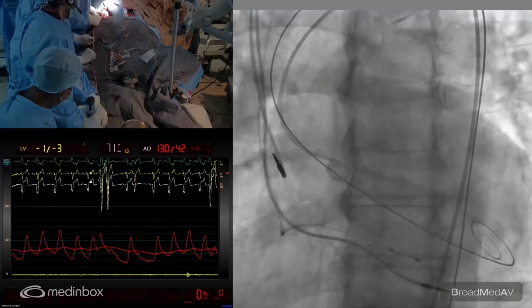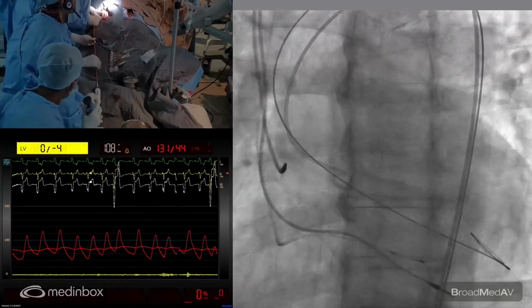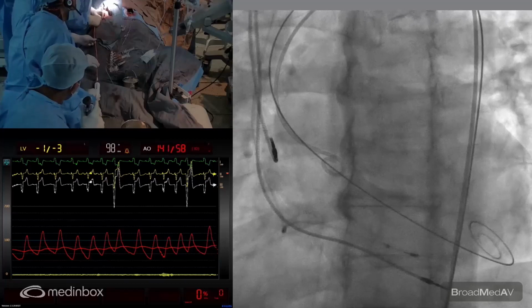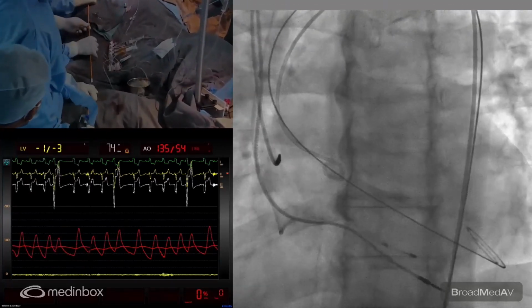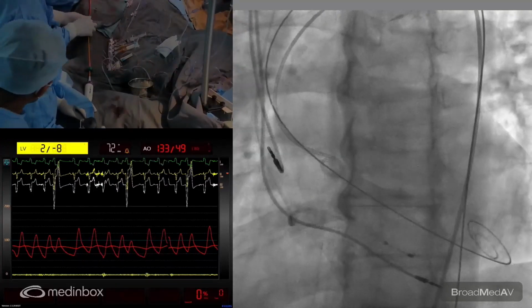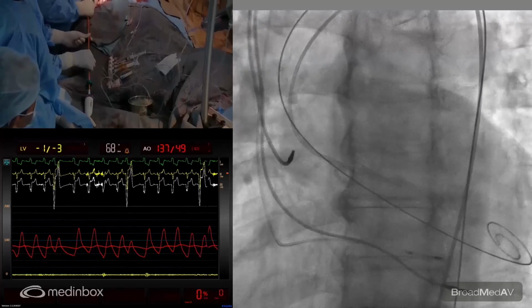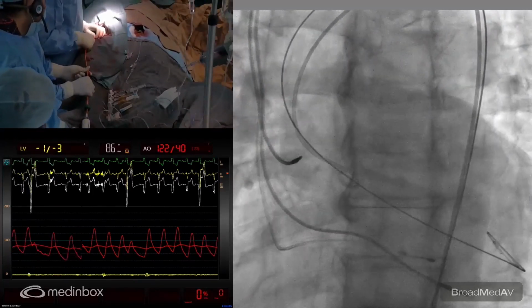So you need to slowly, gently push this off. There's a bit of arm required. Hold the wire back gently, Ashish. Yes. We can remove the loader now. Yep. I'll do that. Very important that you pull the loader out slowly so you don't get a splash. And you're all the time watching the pressure that it doesn't give way.